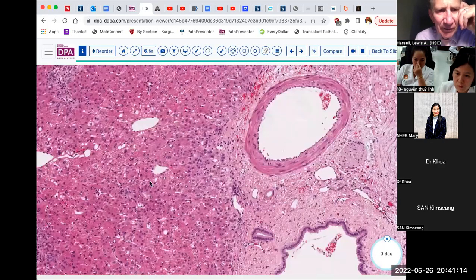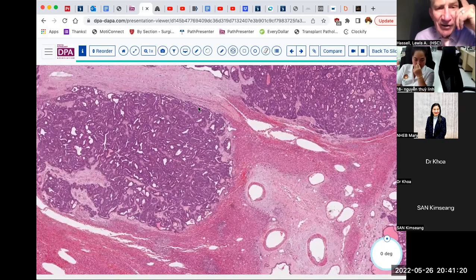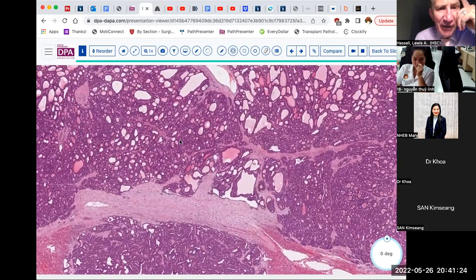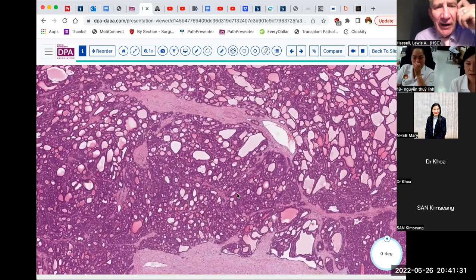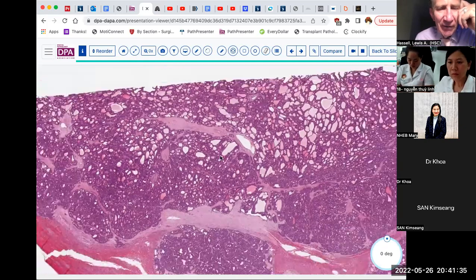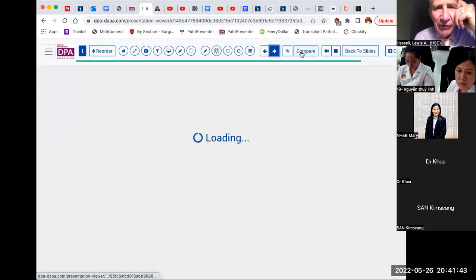So just a nice heads up to see this pattern and to occasionally try a wild stab at an inhibin stain if you think you might be dealing with this sort of a lesion. I think if we saw this on a core biopsy, which I think we did have a core biopsy of this case, we were completely stymied and really wondering about what it might be. So you've seen a rare tumor.